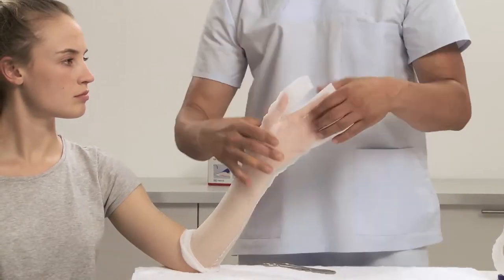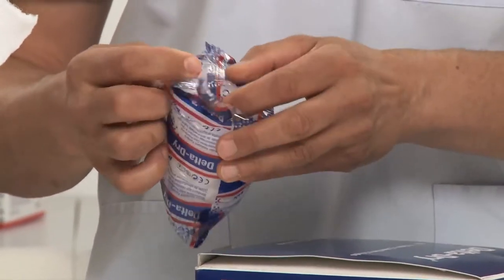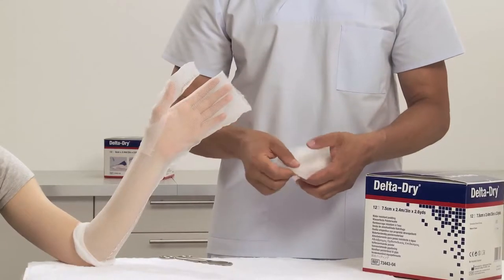Choose the appropriate width of Delta Dry Padding. Delta Dry Padding has an adhesive side for easier application; this side should be applied away from the skin.